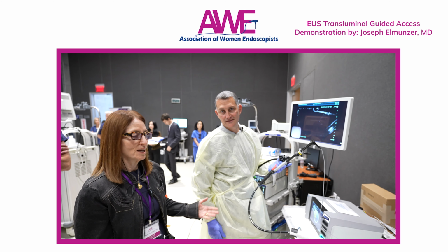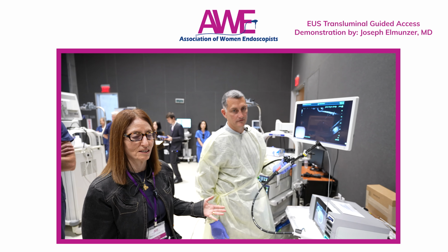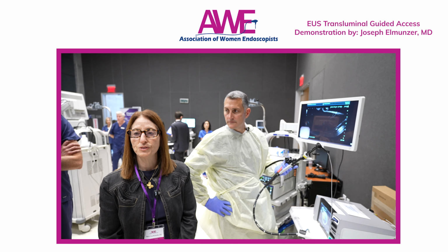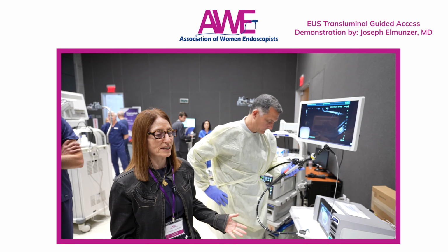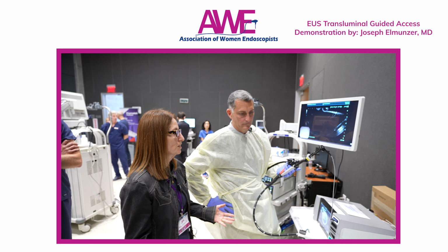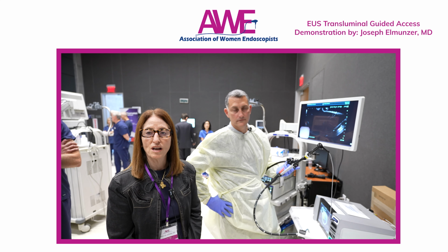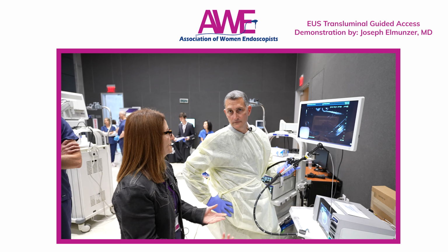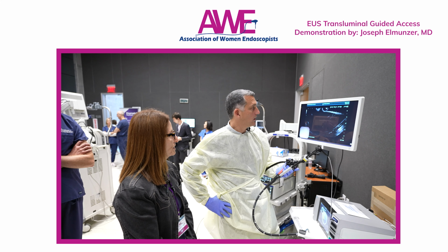Thank you for coming here and displaying this EUS-guided transluminal access that we use in daily practice for access of many different transluminal structures. We're going to focus on access of the common bile duct, but Dr. Elmunzer, do you want to discuss some of the other aspects of this technique?